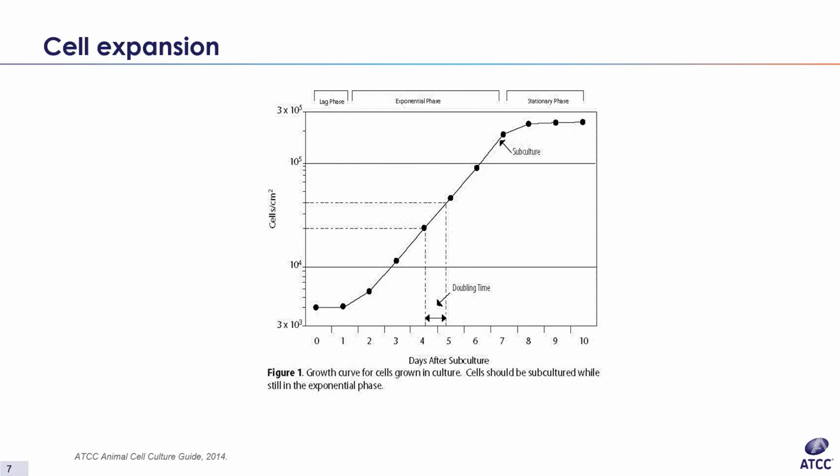To ensure phenotypic stability, cell lines need to be maintained in subcultures in the exponential phase. This will need to occur before a cell monolayer becomes 100% confluent or reaches its maximum recommended cell density. As stated before, that ideal confluency is about 80%.